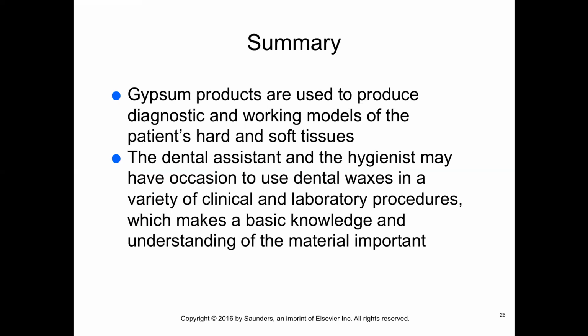In summary, gypsum products are used to produce many kinds of models. You have the occasion to use gypsum and dental waxes in a variety of clinical procedures, so making sure you know the basics of the material is very important. The gypsum material's properties of strength and hardness, setting expansion, and solubility are directly related to the amounts of water used in construction. So taking impressions is something you guys are able to do.